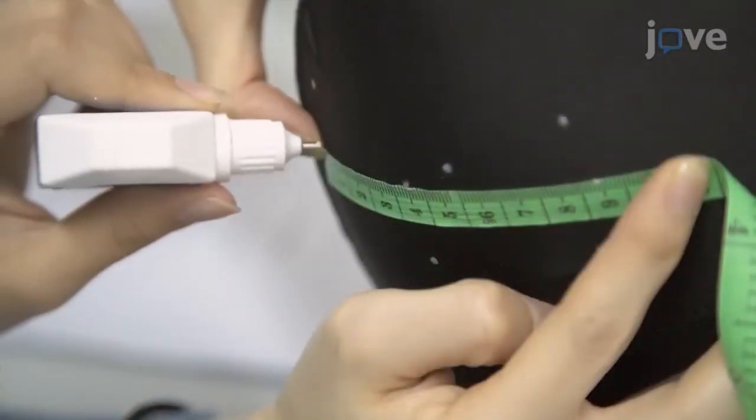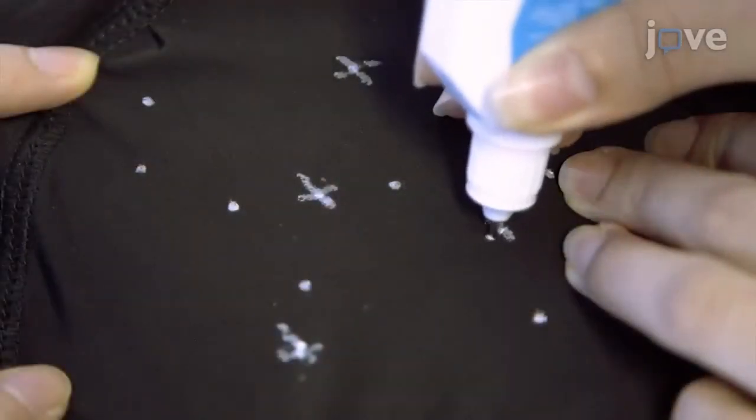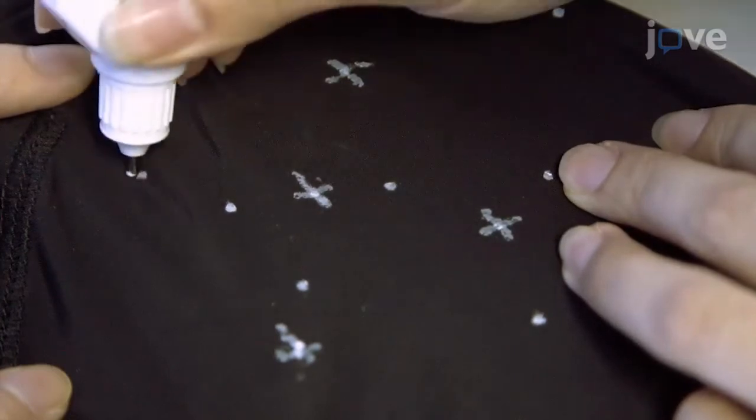Then adjust the radius of the four return electrodes based on the objectives, and mark the center and return electrode locations on the cap.